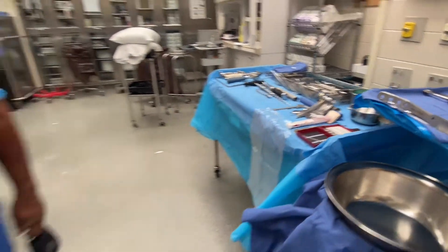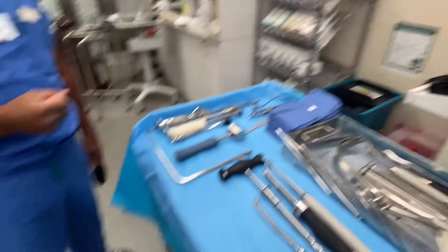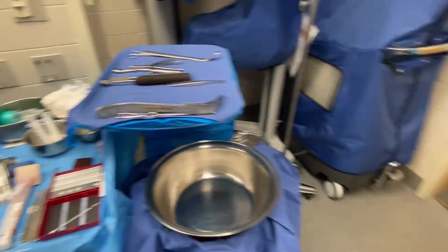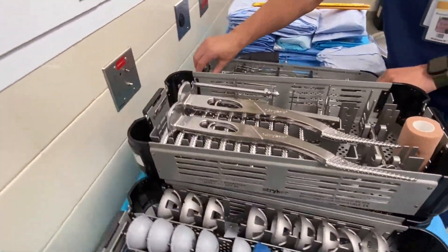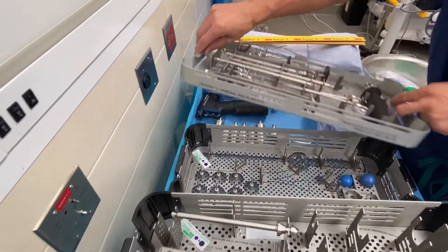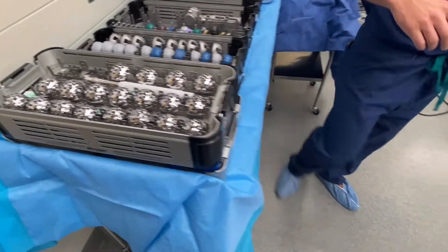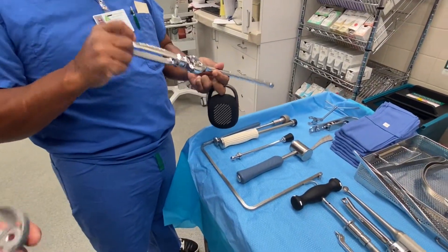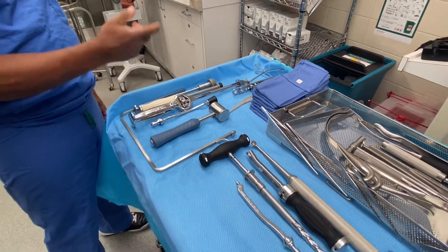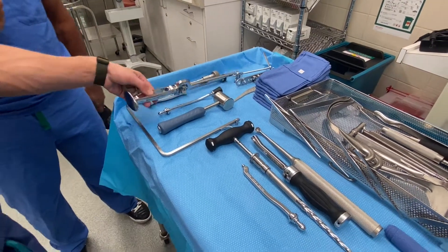I know a lot of people don't, but I usually trial. These are the window trials. When you put the trials on, I don't need this — you can put it on the other one, just the one, just for trial. You put this on and then for the trial I just put it in. That's what you use for the finishing — this thing goes on that.